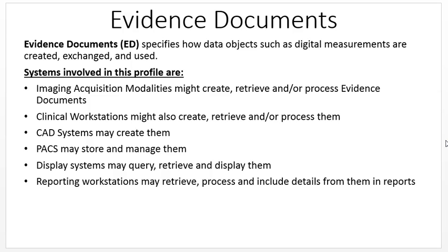The evidence documents profile allows data such as OB measurements, CAD results, procedure logs, etc. to be encoded, stored, and managed just like DICOM images. The modality can store them to PACS. A reporting station can query and retrieve them along with the images. These are like worksheets typically used in ultrasound. That's what an evidence document would be.